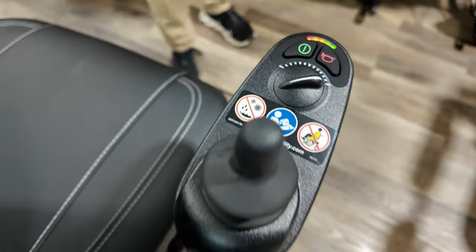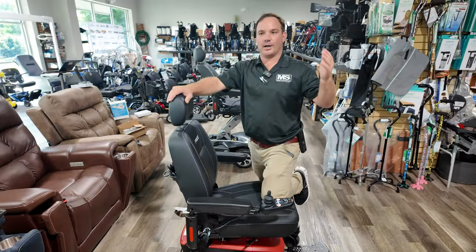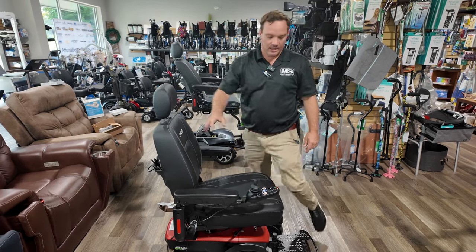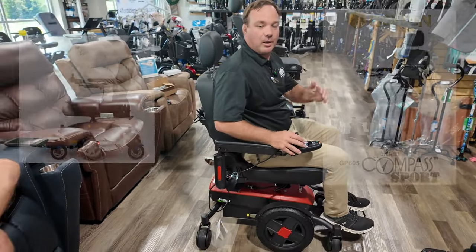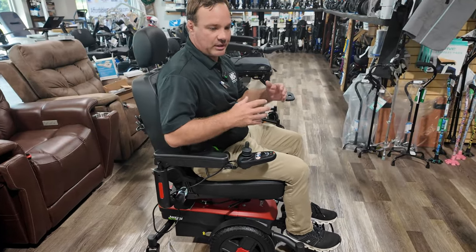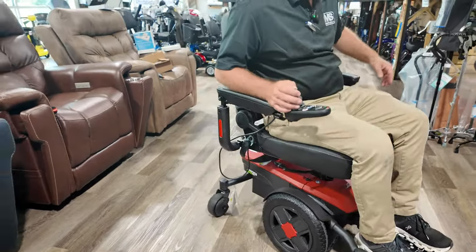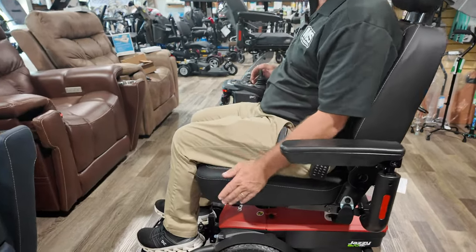Another advantage to the LI: if you're an all-day user and you get up at 7 o'clock, take a nap for a couple hours, this is going to charge up much faster than a chair with AGM batteries. You can also get this in the HD version. This is more of a push-forward design — people will say it's a center wheel drive chair but it's not a true center wheel drive like the Compass Sport. Center wheel drive chairs are really good for inside because the turning radius is more centered, but this might be better for getting over a small threshold.